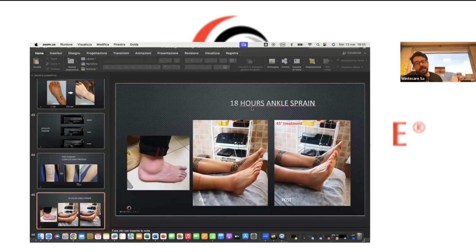And then finally, the patient would lay facing up, the plate under the lower back, the electrode exactly on the gluteus insertion, or let's say at the level of the piriformis. And I would ask the patient to perform a piriformis stretching. So crossing the leg on the other knee, and pulling up my leg in order to stretch my piriformis, of course, with the patient laying down facing up.